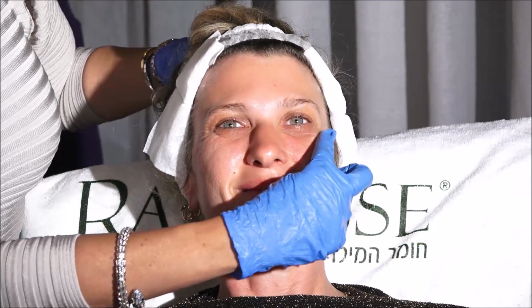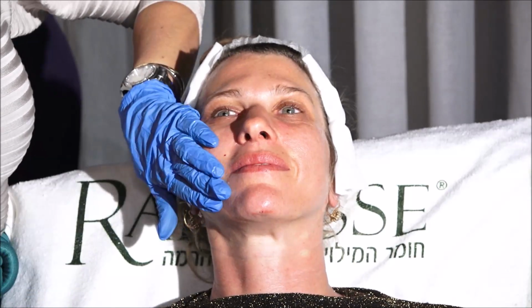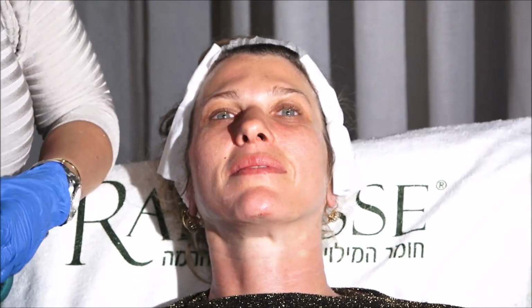And also look how much more natural the smile gets. Smile strong. Than this side. The smile is lower here, and this smile is higher here. I like this because it makes patients like her, who don't have a volume deficiency in the face, look naturally fresh.